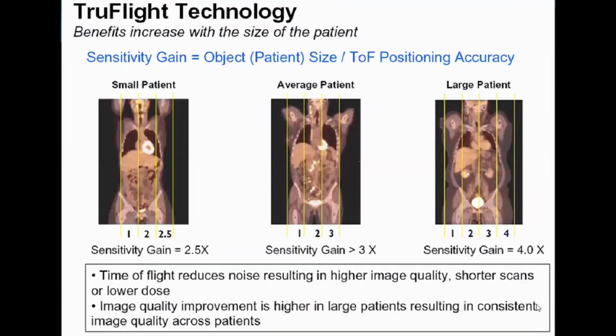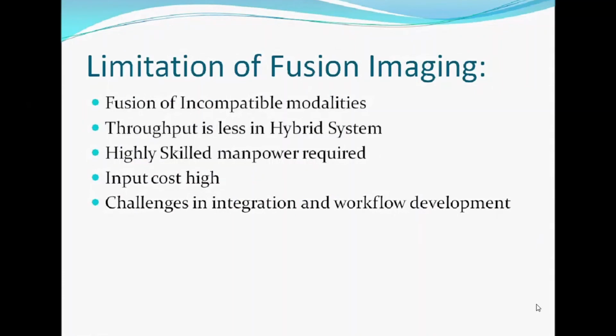So with time of flight technology, the gain is very high for large patients. It's very good for large patients. So apart from so many advantages and the power of PET CT, there are also certain limitations. Still, we are fighting with the initial limitation of fusion of incompatible modalities.